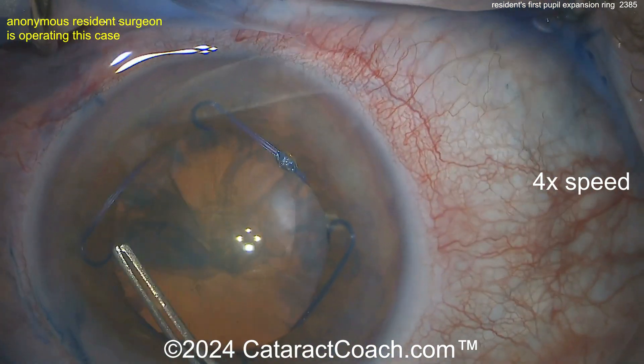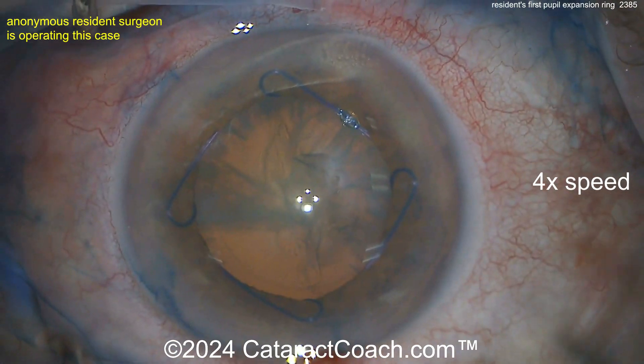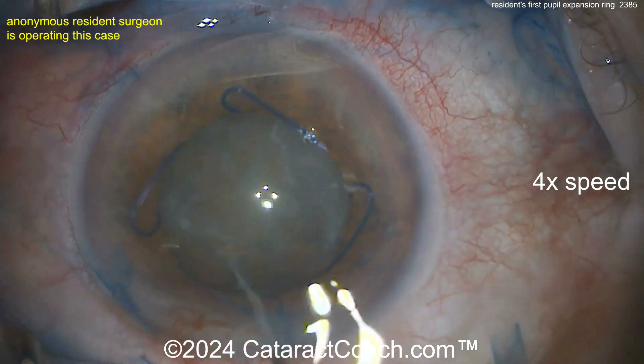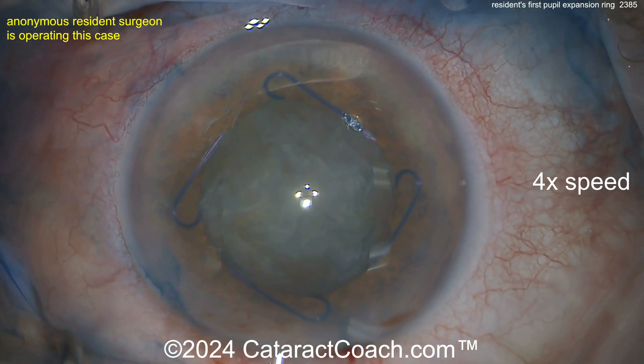Now it's time for the rhexis. The nice part here is it's easy to see for your capsulotomy and you've got a nice guide. This resident is doing a fantastic job — looks like at least a couple hundred cases in, probably around 200. Now here's some hydrodissection. Don't prolapse the nucleus out of the bag because you may dislodge the ring, so keep that nucleus in the bag.